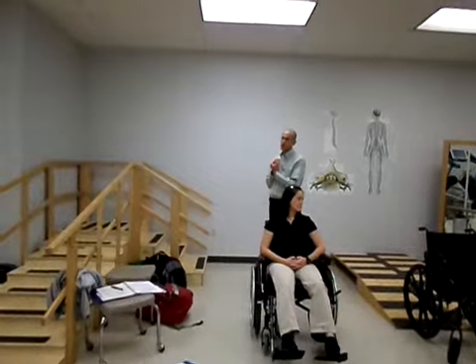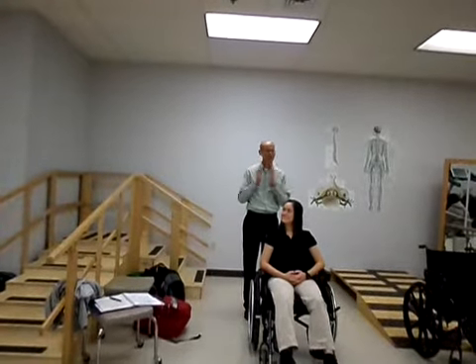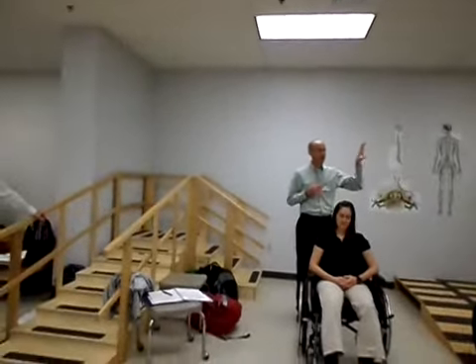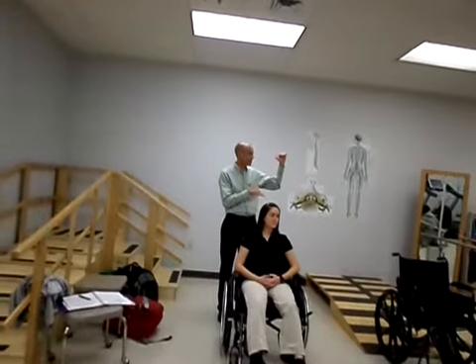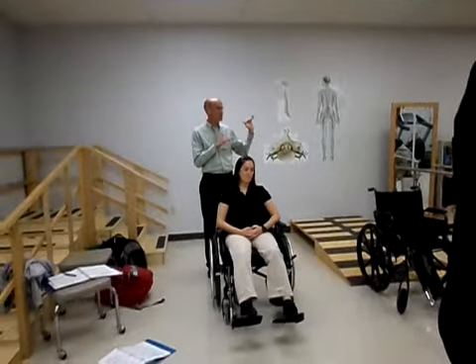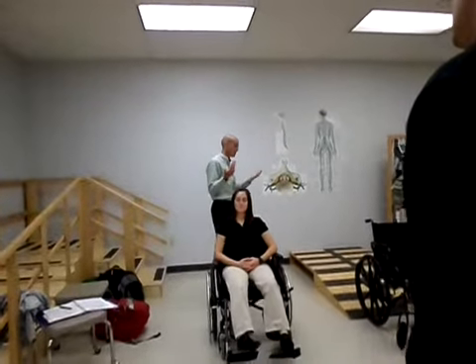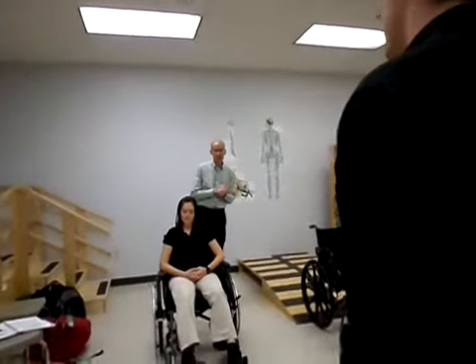By the way, why are we doing this? Because we'll be doing this in order of location. Possibly. And I meant to project something that showed a handout I gave a patient at Baptist once that explained how to go up and down curbs and stairs in a wheelchair, because a family member was taking the patient home in a wheelchair. So this is a possibility that you would have to teach someone how to do this.